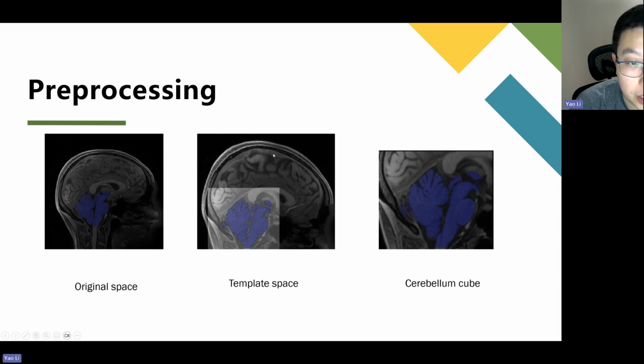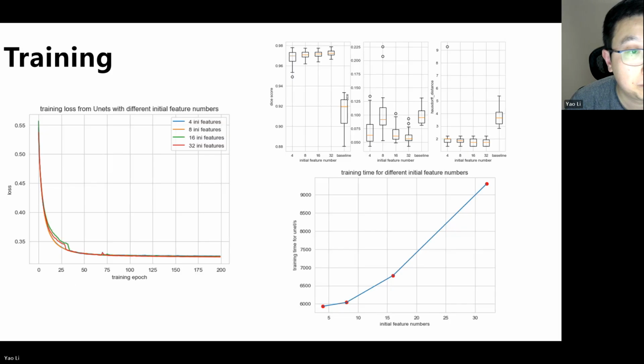Other information about the head is not really relevant to the task, so we don't need to put the whole image into the model. On the right is the final data that the model actually gets. The blue volumes are where the mask is labeled as 1. Once we have our training data, we can start training our model.